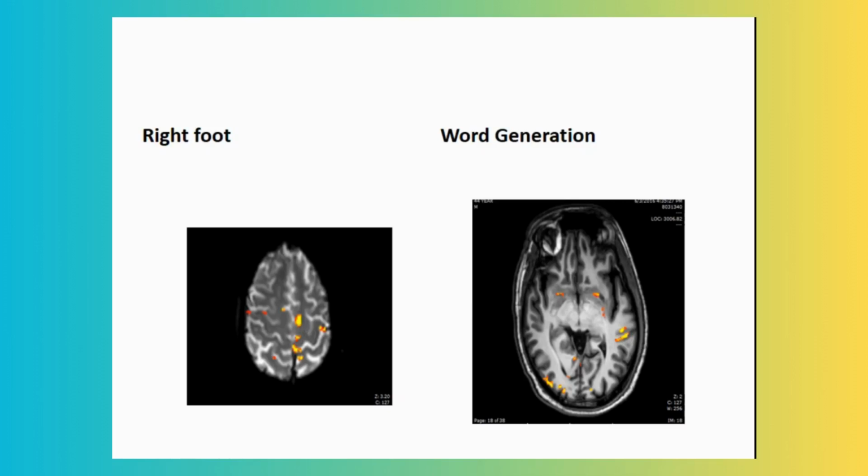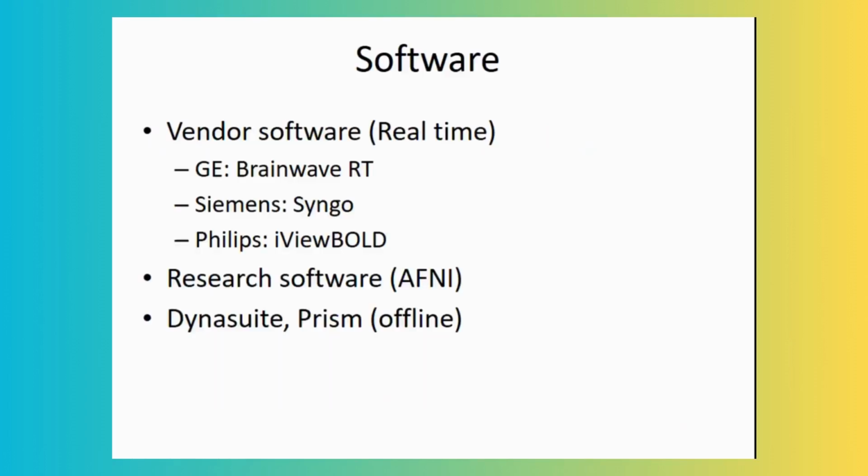The occipital area signals are due to visualization of the screen. We are not interested in these areas. We are interested in the language areas, Broca's area or Wernicke's area, and in the motor area we are looking for the premotor area, sensory motor area, or association cortex area. These signals can definitely be due to other things the brain is doing by that time, like visually looking at the screen.